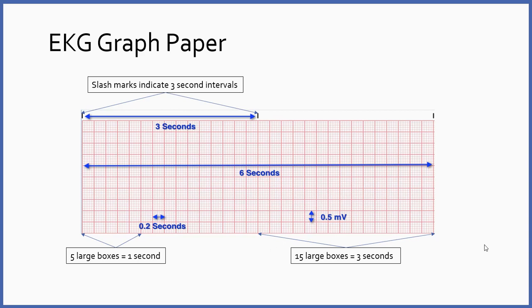Once again, why am I going to make you look at the time? Now, you see monitors with EKG displays, or you look at printed EKG strips, and the heart rate is typically displayed or printed. The monitor, though, is sometimes just not that smart about picking up on artifact, and things like that could give you an incorrect rate. For that reason, it's always a really good idea to know how to estimate heart rate. And because I want to reinforce the concept of time on the strip, I'm going to make you calculate some heart rates. I deliberately took them out.